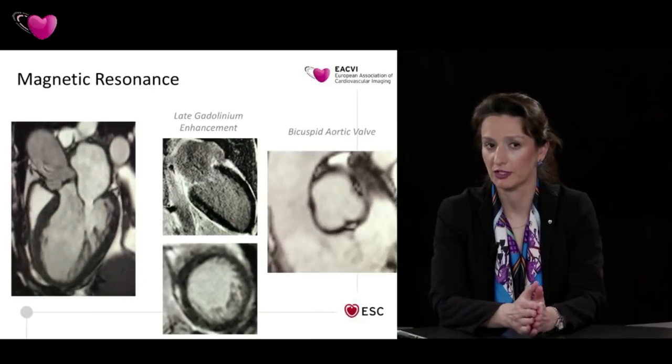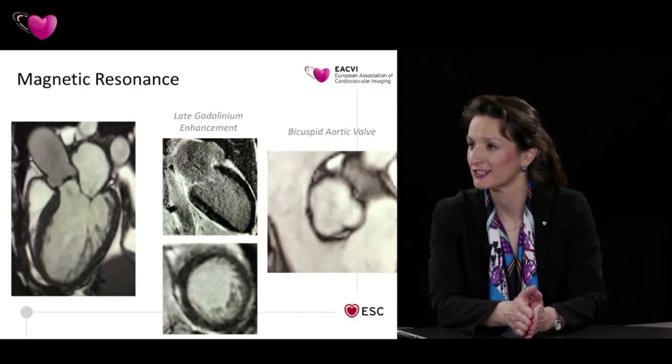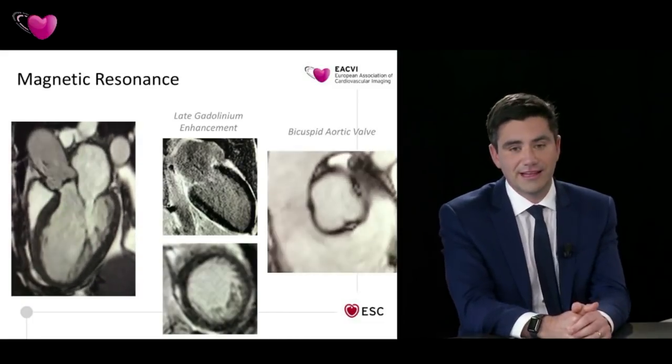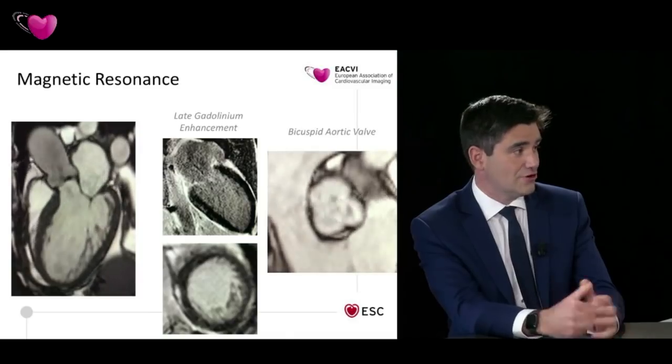You know better the function of the ventricle. You know that there is no scar, but still, does it answer the question whether this is a true severe aortic stenosis? Yeah, I don't think it does. But I think what it gave us the confidence to do is to move forward to the next phase of investigations. And we thought that we should be at least considering TAVI in this patient.